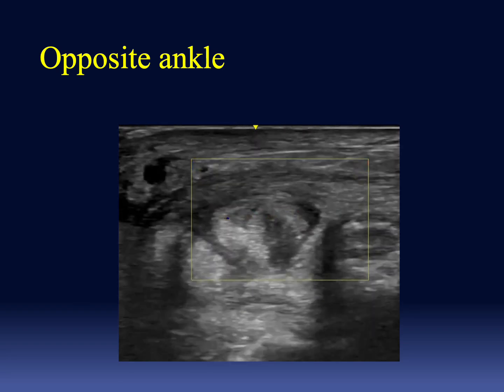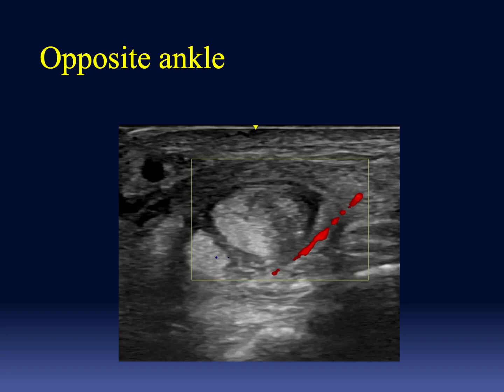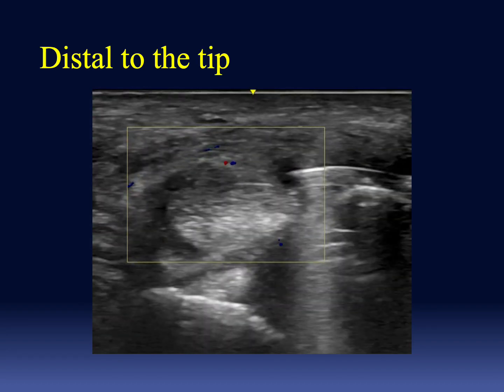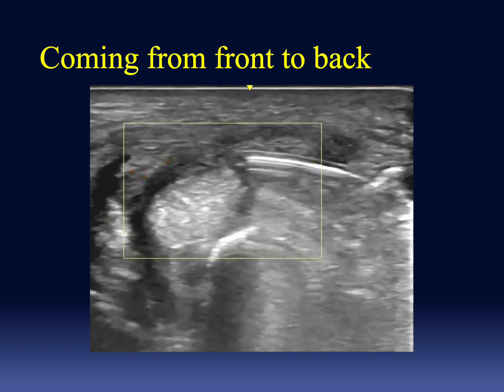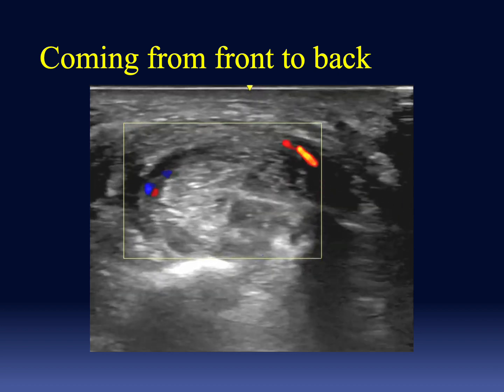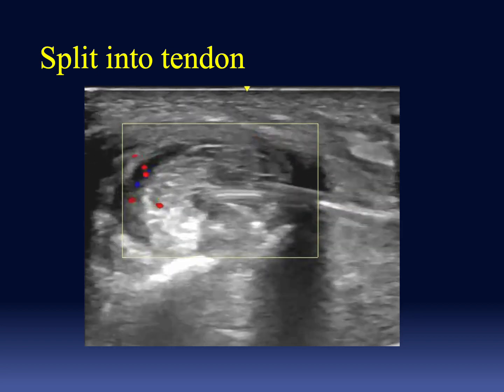The opposite ankle we can see in this image, which has been flipped to make it consistent with the left ankle. We can see the two echogenic tendons, the larger being the posterior tibial. If we go distal to the tip of the metal, we can see a fairly normal looking tendon. But then if we follow it to the back and up the back side of the plate, we can see it decrease in its echogenicity and become deformed by the plate. The plate seems to split the tendon.